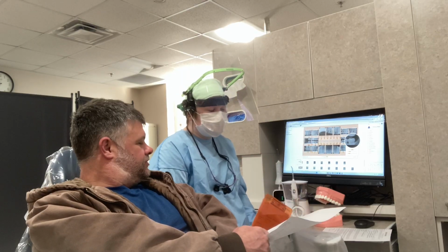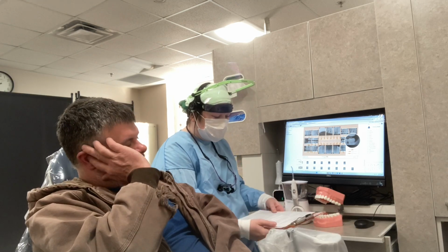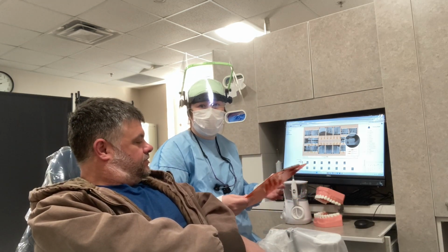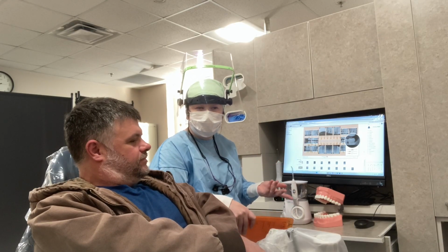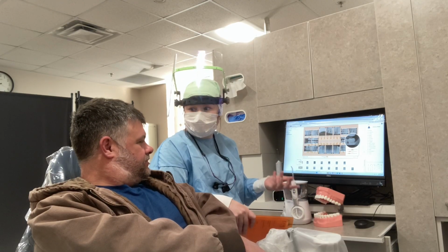I guess we'll go back to our perio assessment again, so the gum health. Because that's the biggest thing that we're focusing on with you since you have the mild bone loss, is how can we help that, and how can we not necessarily prevent it, because once you have gum disease, it's irreversible and you can't get that bone back. But we can arrest it or stop it.